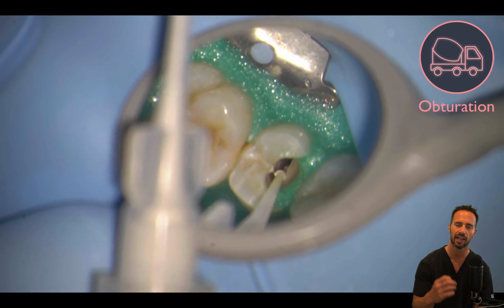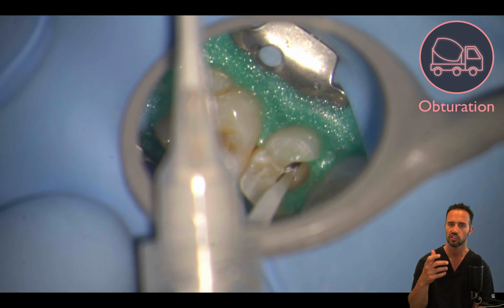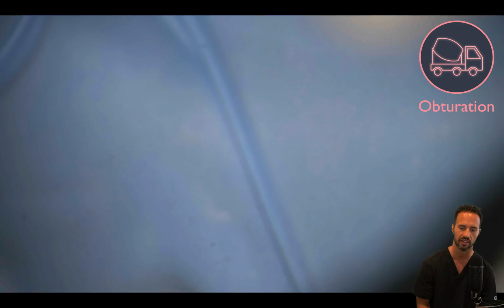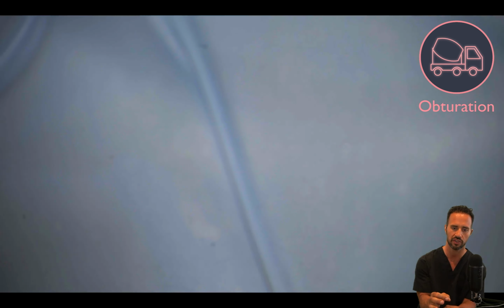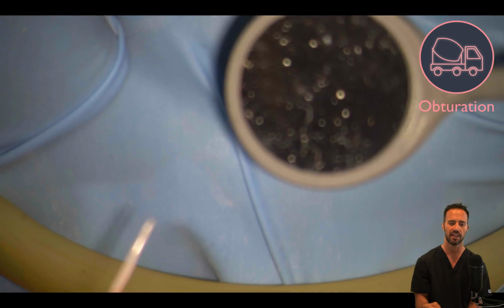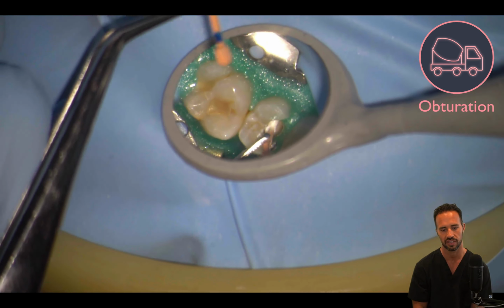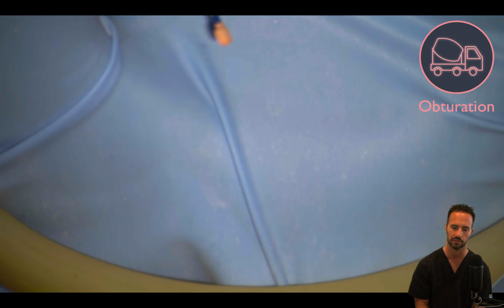And now we're introducing our Premolar BC sealer into each of the 2 canals, injected directly in. Just make sure that it's a passive fit so you're not squirting any sealer through the apex. And then removing the sealer tip and dunking the gutta percha cone that's been crimped at the appropriate length into that tip, and then introducing that into the 2 canals. First into the buccal canal, all the way down to the crimp, and then to the palatal.